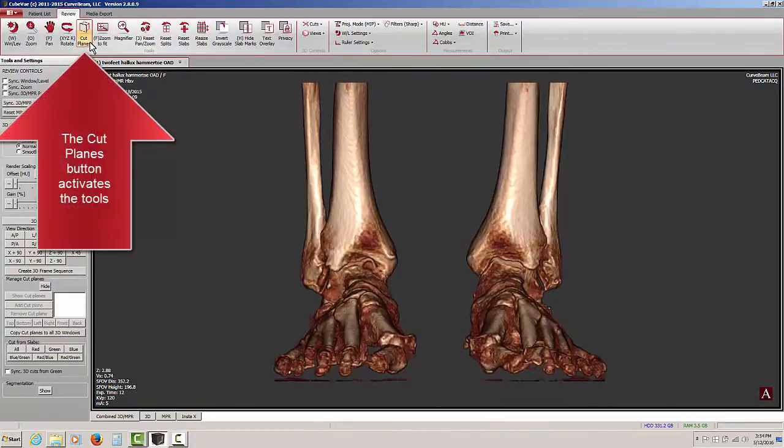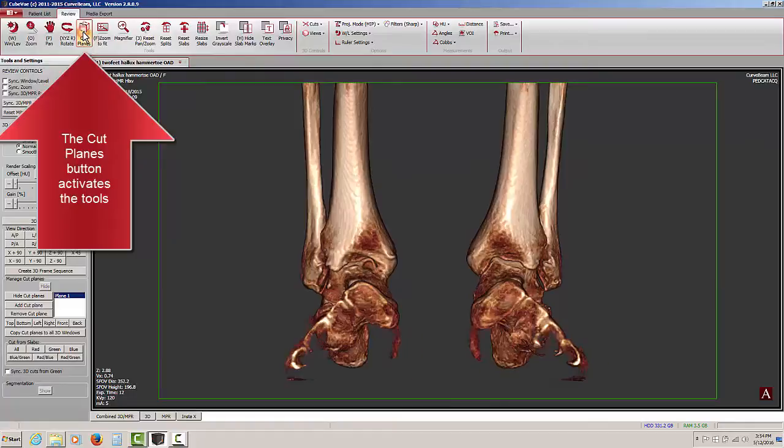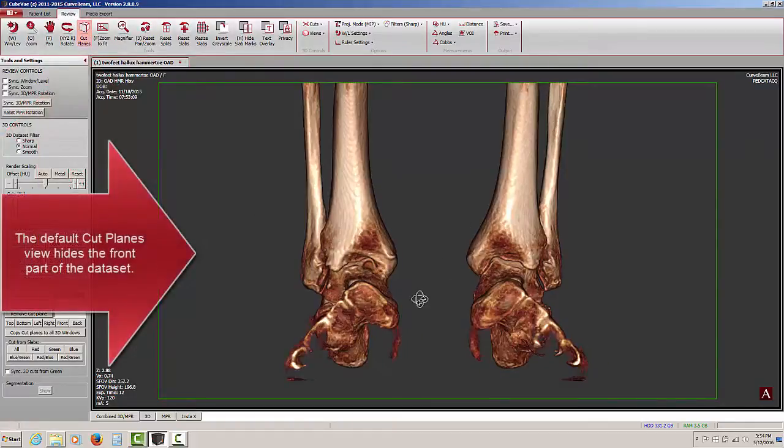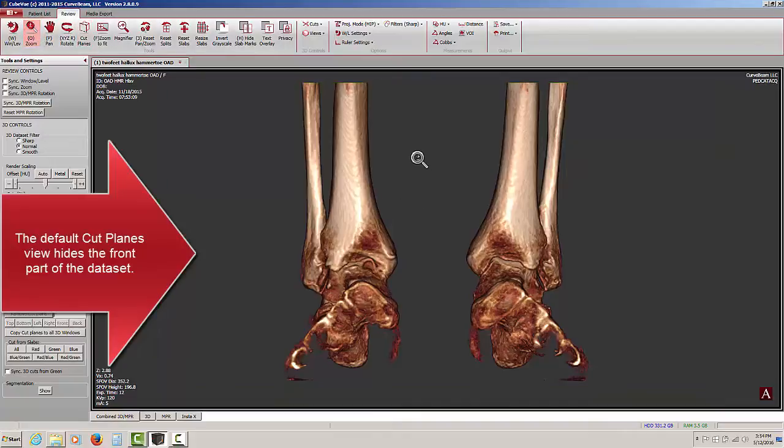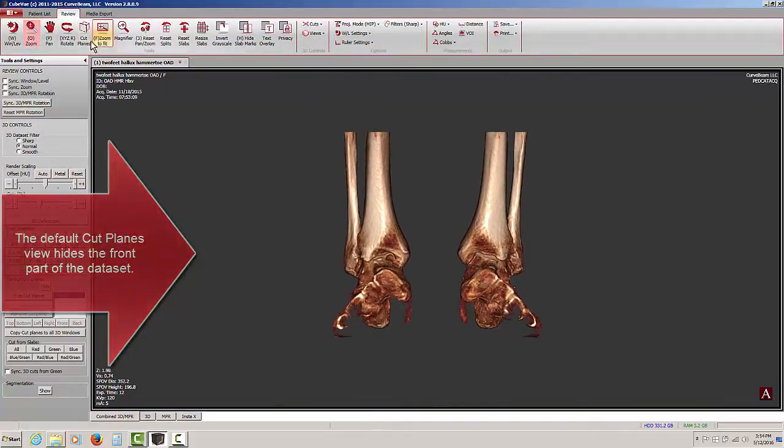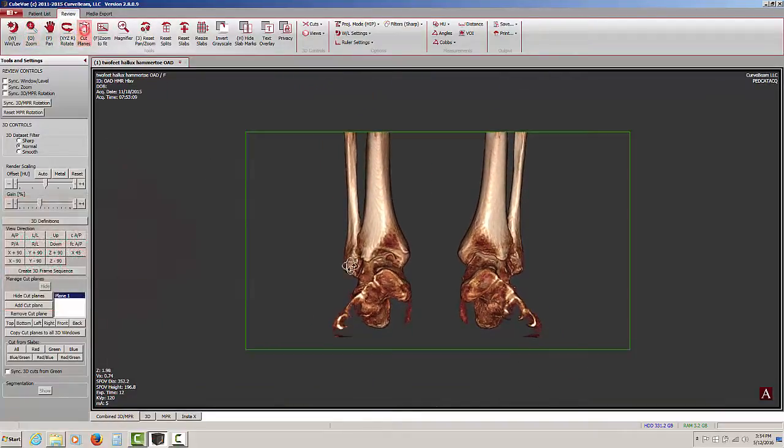In the top ribbon, we see the cut planes button. Pressing on that, we see immediately it looks like part of the data set has been removed. I'm just going to zoom out a bit, press that cut planes button again.